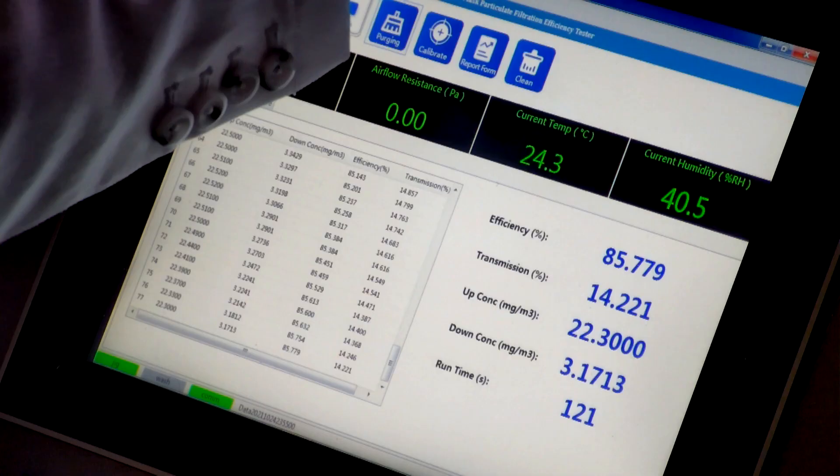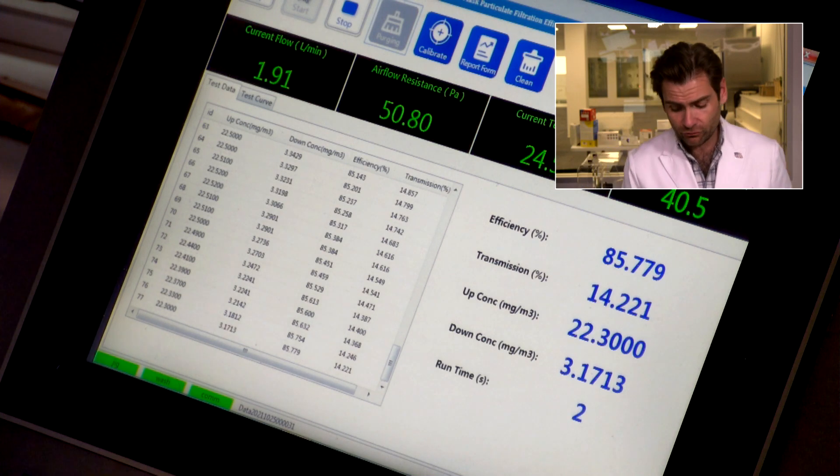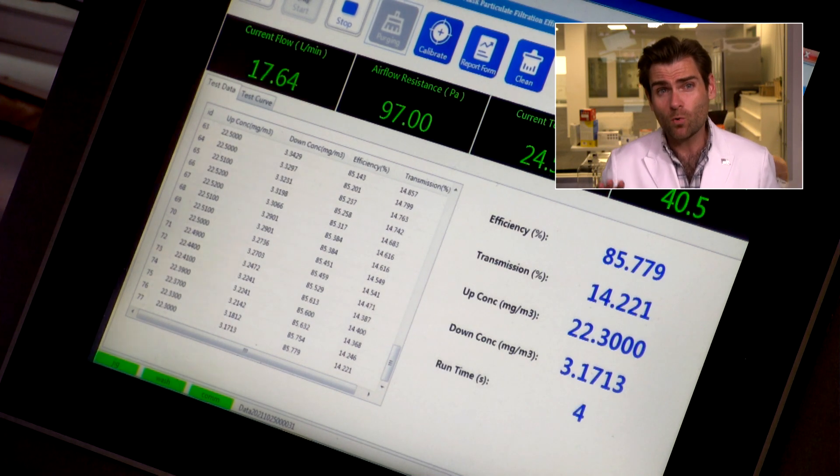It's a good clamp and we'll let it rip. This is a PFE machine — particulate filtration efficiency machine. We are doing the N95 test here on this KF94, so it should pass at 94%. Let's see what's going on here.